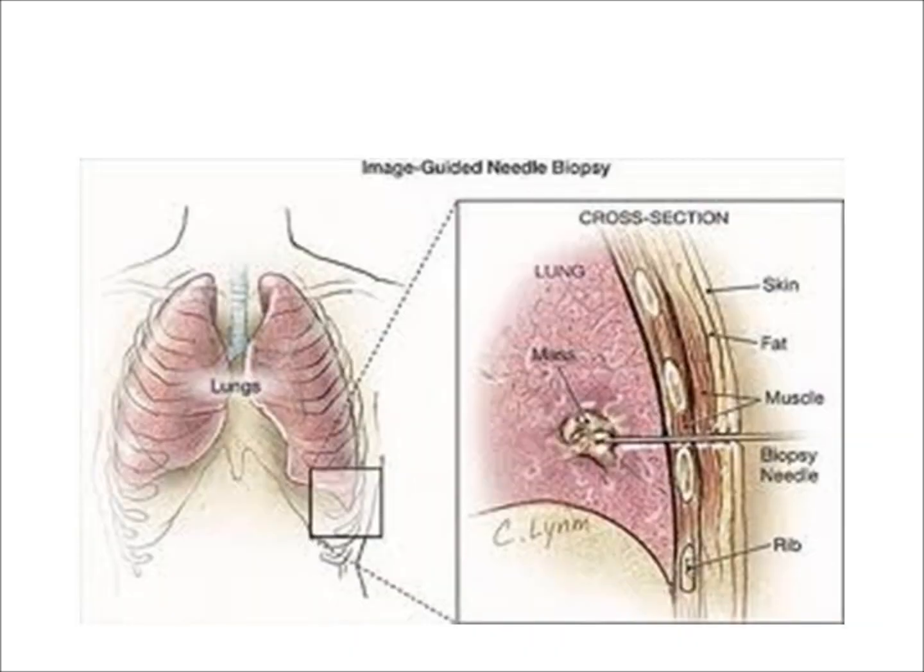Now, the first bronchiogenic carcinoma that you will examine is an example of small cell carcinoma. This figure illustrates how this sample was obtained. In this case, a needle was passed through the skin into the lung and a small core biopsy was removed for analysis. However, biopsies may also be taken through the bronchus if the mass is centrally located.